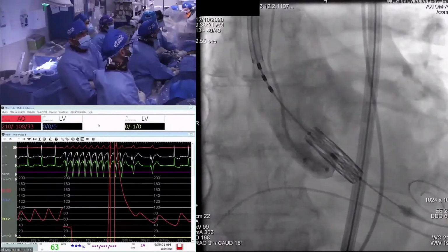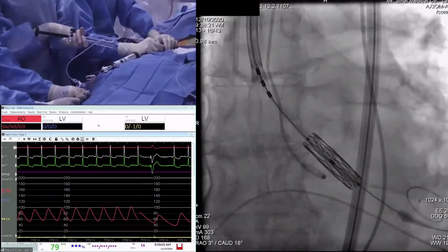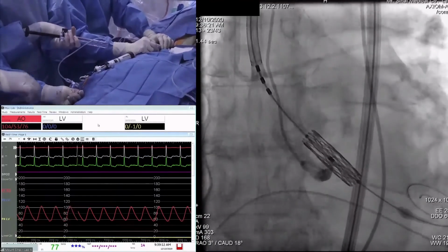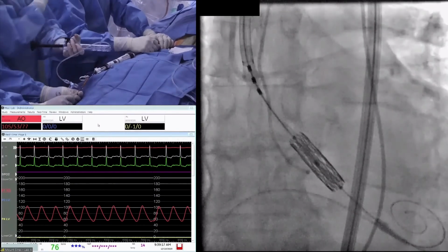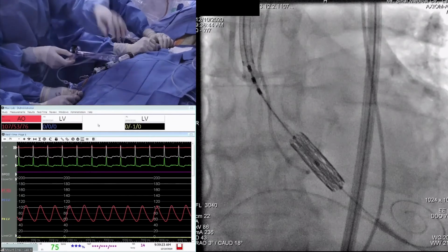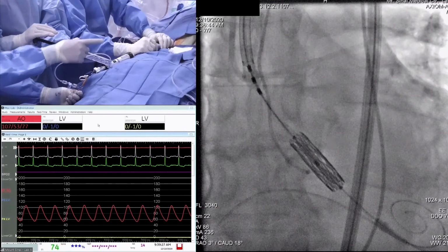And this is the time where you tell everybody to be on the same page. You tell our cardiac anesthetist also that we are going to go up, because remember, I always say, compared with surgery, the whole process is slow. It takes time. Slow means that it's accumulative. And here it is all or none. So everybody should be ready in case there is a problem getting the blood pressure up. Give rapid, high doses of epinephrine to bring the pressure up.